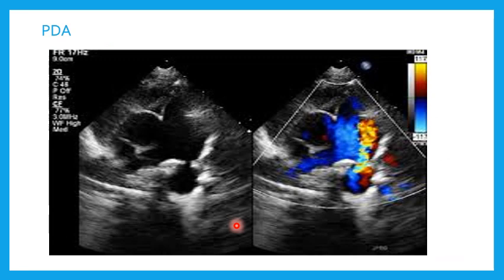Then finally, from POCUS, we can assess the presence of the PDA, especially with neonates and patients we suspect are duct dependent. So we see if this patient has a PDA that needs to be opened by starting some medication. We can get this from the high parasternal short axis.